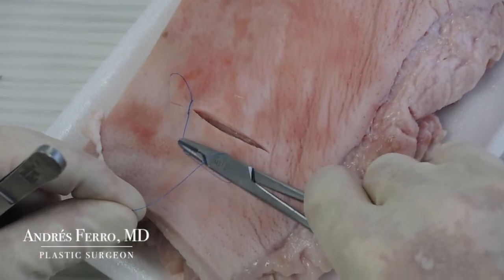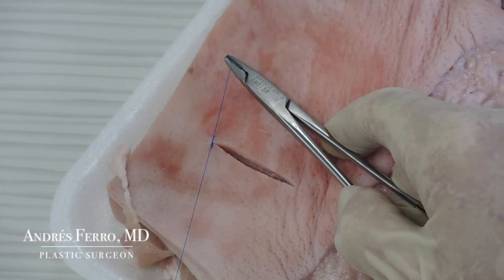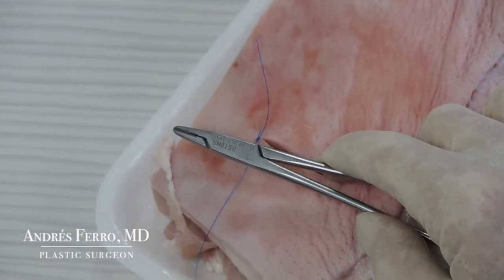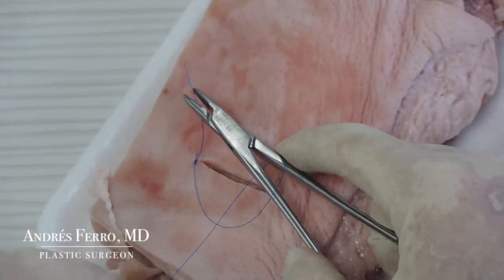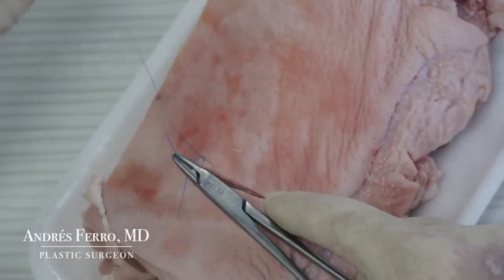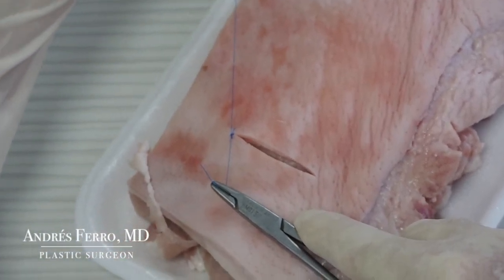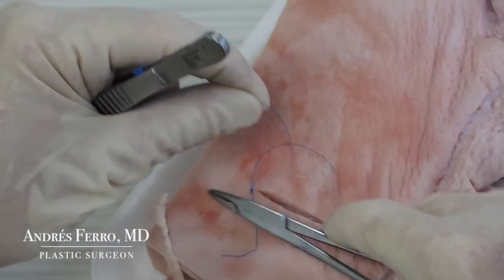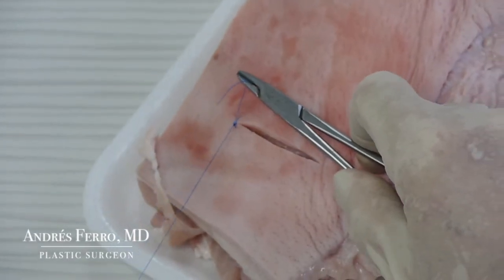Now make a single loop in the opposite direction to the previous one — in this case, backwards. Take the distal end of the suture and tie the second knot. To do the third knot, proceed in the same way: place the needle holder parallel to the wound, do a single loop — this time forward — take the end of the suture and tie the knot. Continue in the same way to make 4-5 knots to the suture.